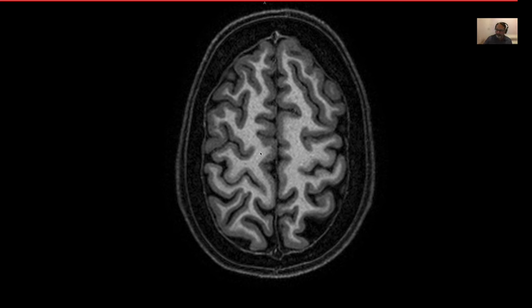And of course, I think I did mention this in the last lecture also, the gray matter shows up gray on MRI. That's the gray matter. And then this is the white matter that shows up white, lighter on MRI, which is actually the way it is in the actual anatomical way. However, in a CT, it's the other way around. The gray matter actually shows up lighter than the white matter because the gray matter is a bit more dense. The gray matter is full of interneurons. That's where all your thinking happens. And the white matter are the myelinated neurons, the pathways. We'll do some of those pathways also. But you should be able to see the gray matter and the white matter and the sulci and the gyri. In an MRI, they're far more obvious. In a CT, they're not too obvious.